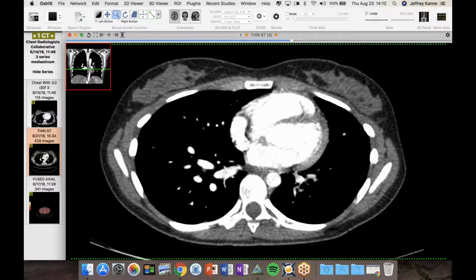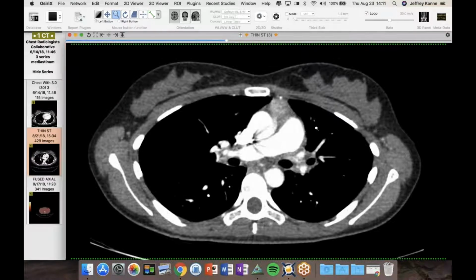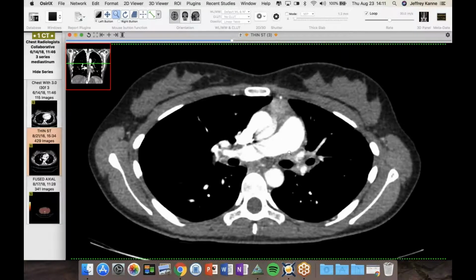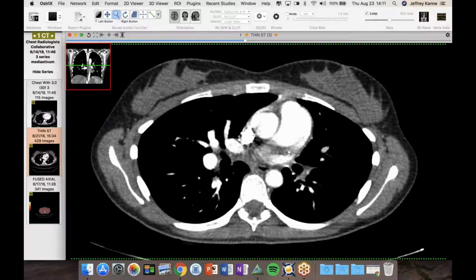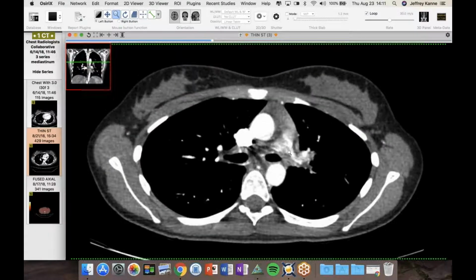The lack of PET activity too makes you wonder if the immunosuppression will help. Is this all just chronic and irreversible? Yeah, well, it's not progressing at this point. Well, in the older scans, the right upper lobe was okay, so she's starting to lose that right upper lobe, and with her PFTs getting worse, it's worth a shot to stabilize it, because she won't be a transplant candidate almost certainly, and there's really nothing else to do.